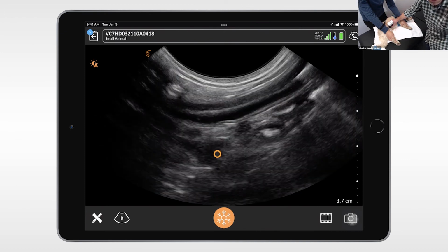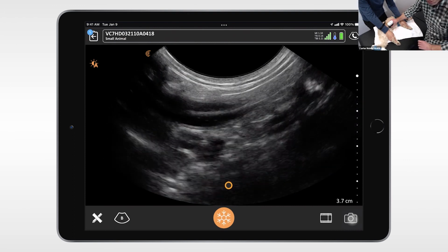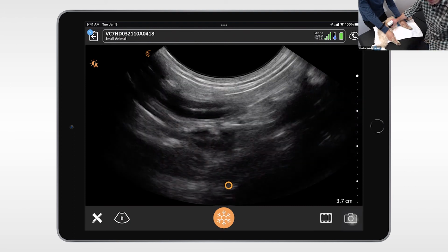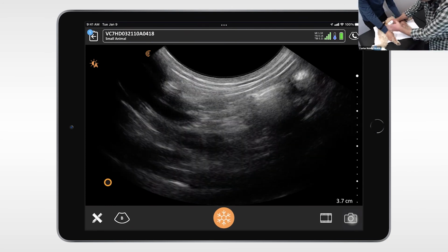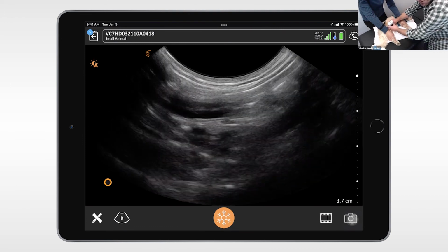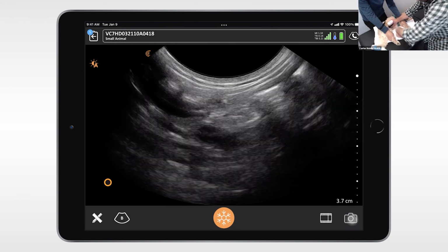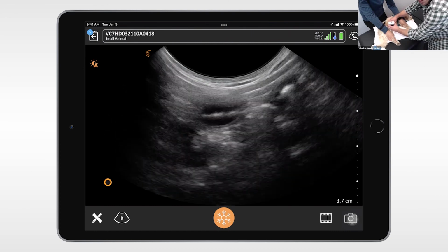Yeah, so if you rotate the probe 90 degrees, you'll get the transverse view of the duodenum, and that can make it a bit easier to see. And do I want the indicator to the back when I'm rotating it, or towards the... I usually rotate it the other way. So this way, indicator down. Ventrum, yeah. Okay.